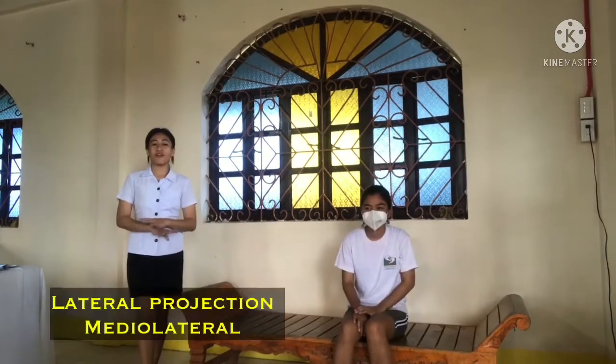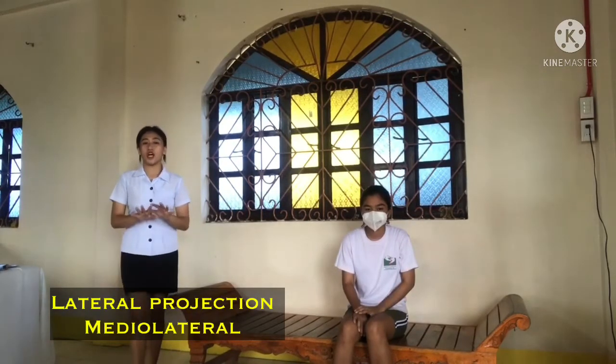So last, we have the lateral projection, medial-lateral. So the IR used for this projection must be 18 by 43 centimeter lengthwise. So place the patient in supine position and ask the patient to turn onto the affected side.